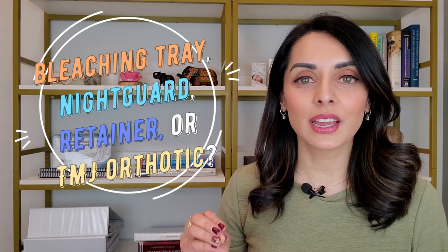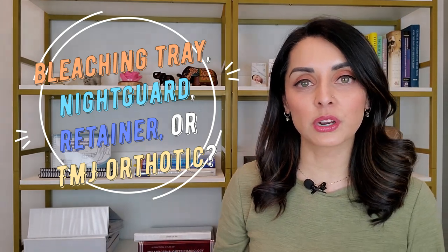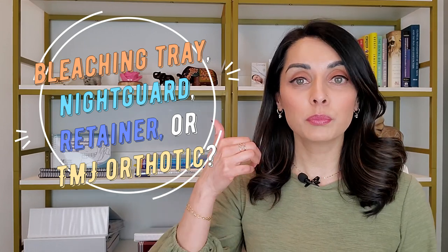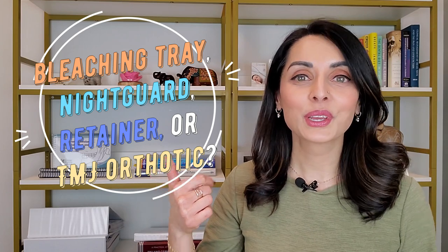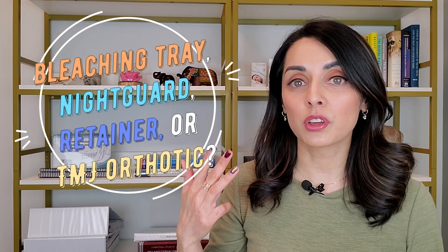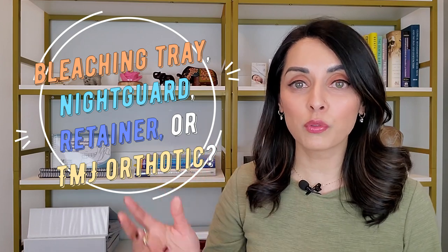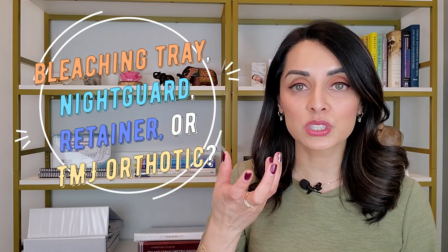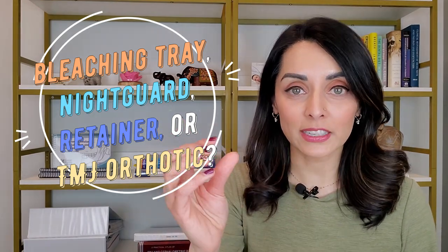Make sure you watch until the end because there's a lot of information here and there's a lot of confusion about the difference between bleaching trays, also called whitening trays, retainers, night guards, and TMJ orthotics. I'll be going over all four of those and even showing some examples, whether it's images or examples that I have to hold in my hands and show you guys.